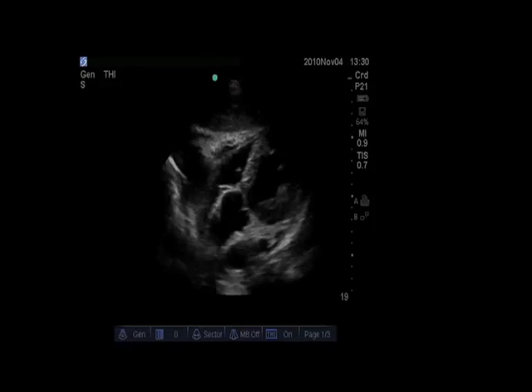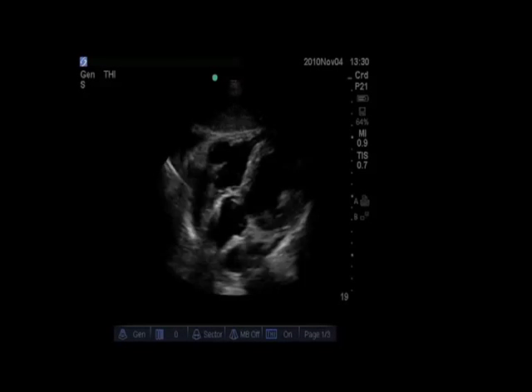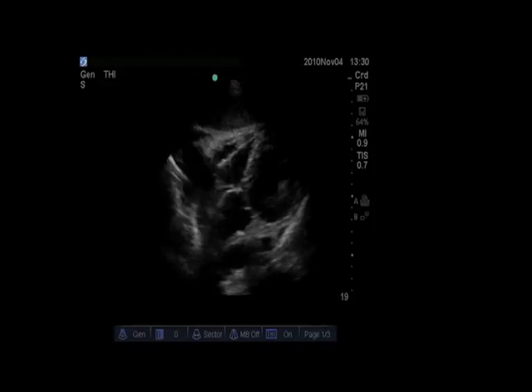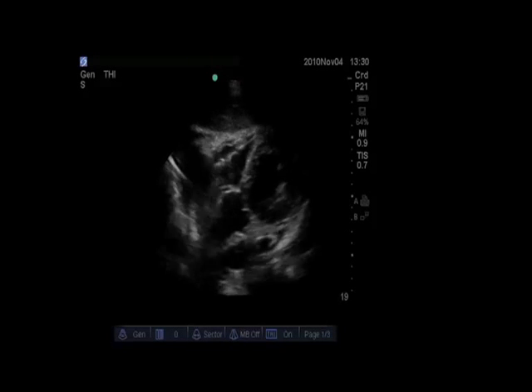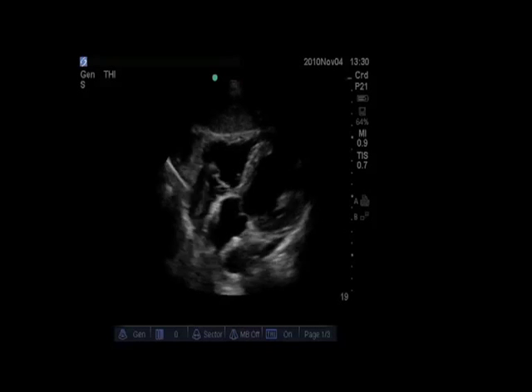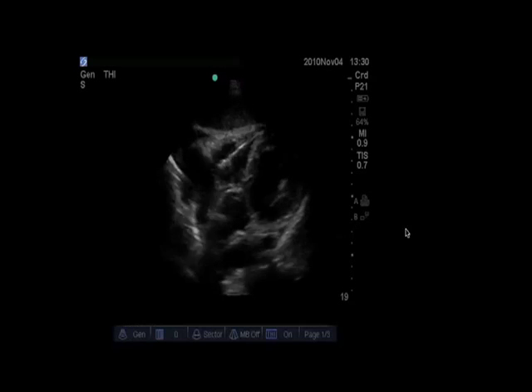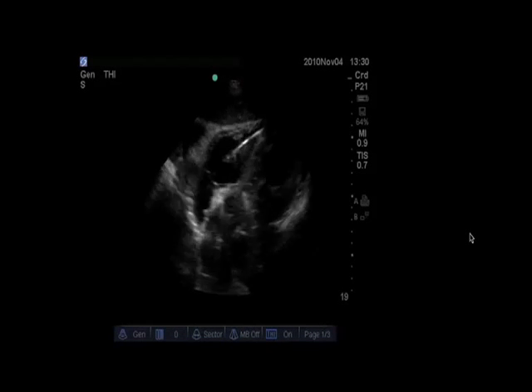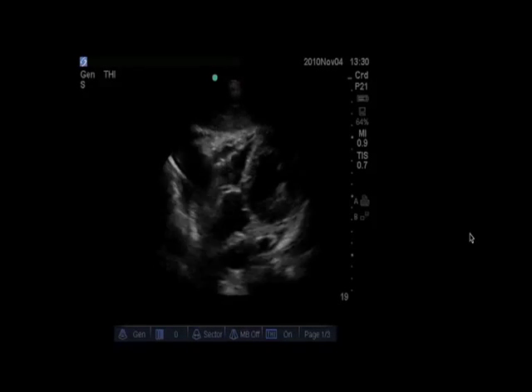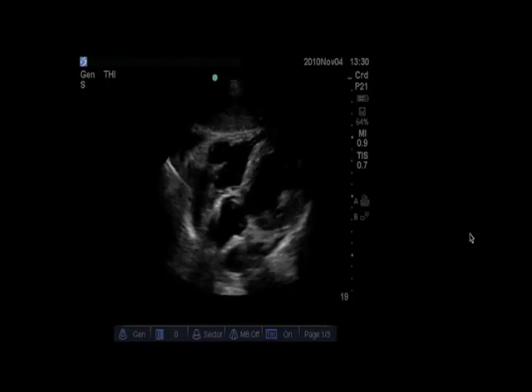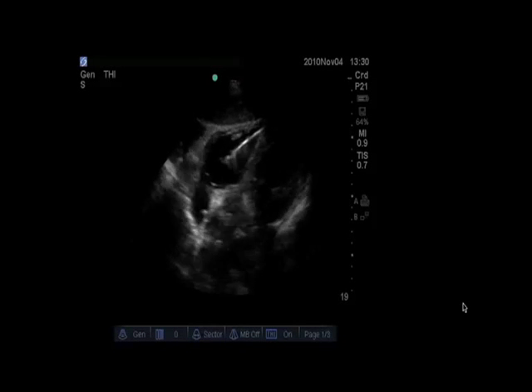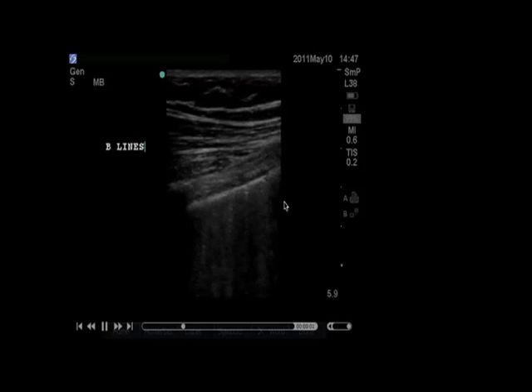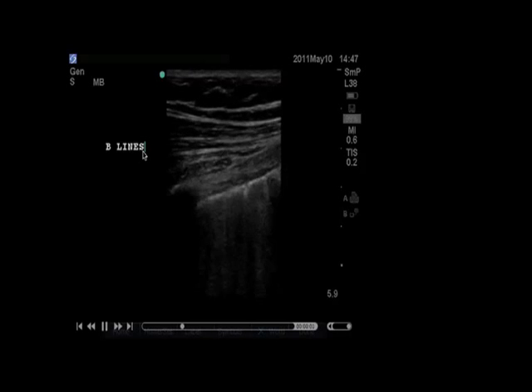Now that you know how to save images, the question remains: when you save an image, there's no immediate way for anyone reviewing them later — for education or quality assurance — to know how you interpreted them. We have a paper-based charting system, so the report in the patient's chart is not easily accessible. We therefore designed a system where you annotate your clips or still images to communicate what you thought. For instance, in an image of a small pericardial effusion anteriorly with no text on screen, we have no idea whether you saw it or not. As a counter-example, an image of pleural ultrasound with B-lines extending from the pleural line — suggestive of congestive heart failure — has 'B-lines' typed on the screen.